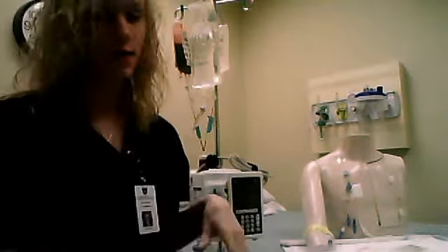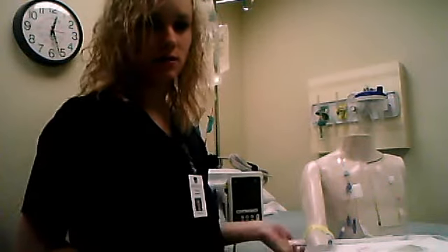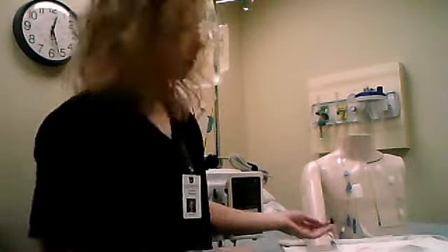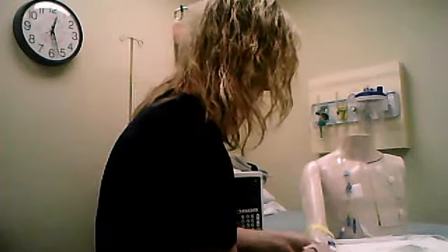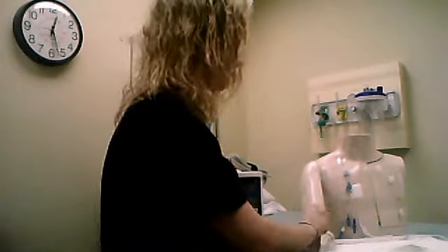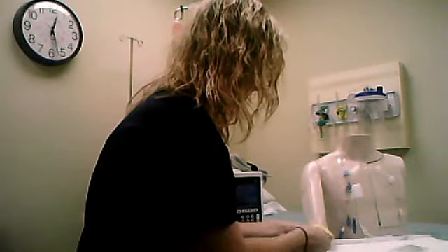Alright, and I'm going through my last 5 rights. Pat, can you tell me your last name and your date of birth? He tells me Smith and December 18th, which is matching. He's got a PICC line in place, so that's what we're going to be using, this hub right here. And we're ready to go. I'm going to clean this for 30 seconds. We can connect our drug.